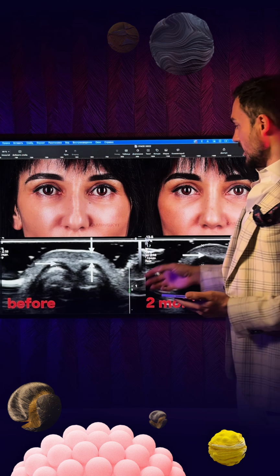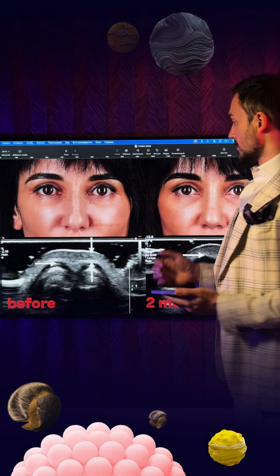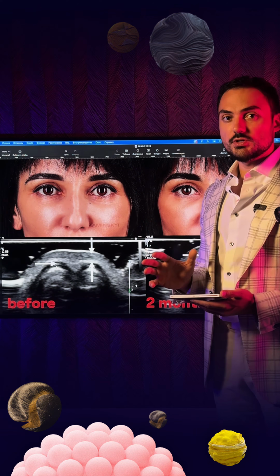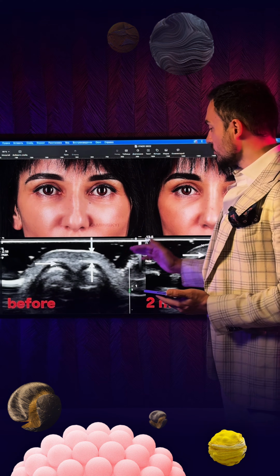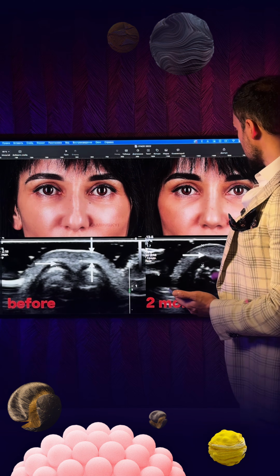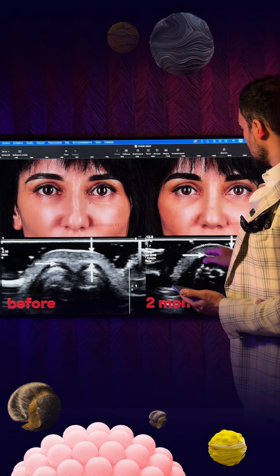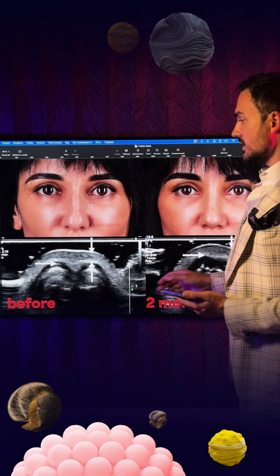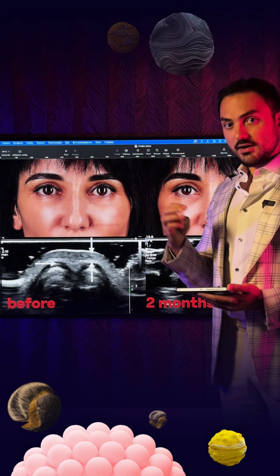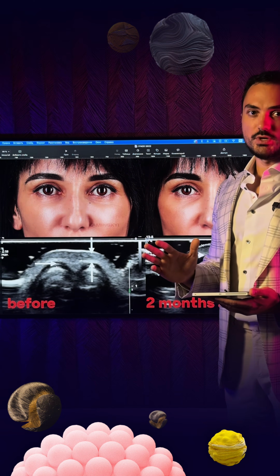And we know if the thickness of the layers is the same, for example 90%, we have the final result. When we are doing the ultrasound examination, we can control the position of the cartilages before and after. We can see the stitches, we can see the scar tissue, and we can see the symmetry of the structures and of the elements. It really helps to understand, should we do the correction after the rhinoplasty, or maybe we just need to wait and everything will be good.